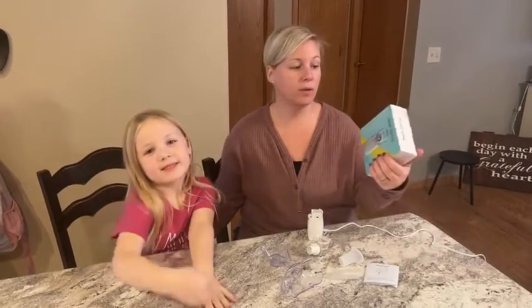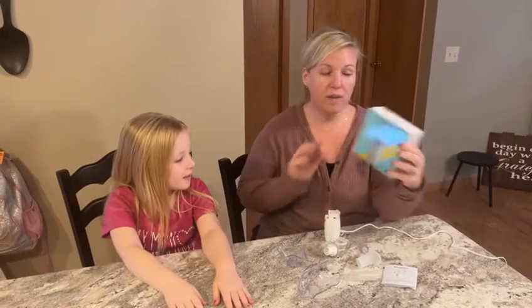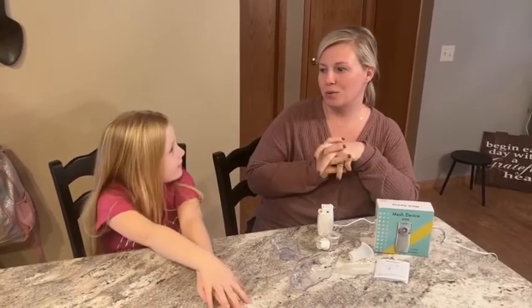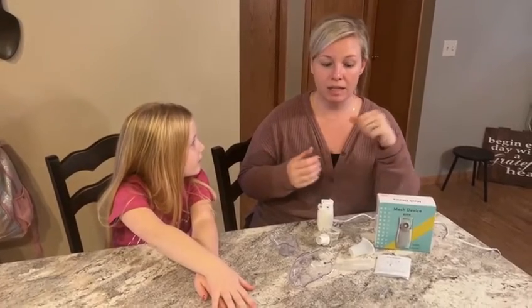Hi, my five and a half year old daughter and I are here. We wanted to give you a quick review of this mesh nebulizer. We are in the heart of cold season here. We live in the very northern part of the country, and my daughter's in kindergarten and coming home with lots of new germs, so we've been needing some neb treatments recently.